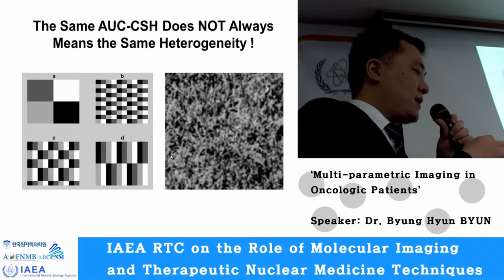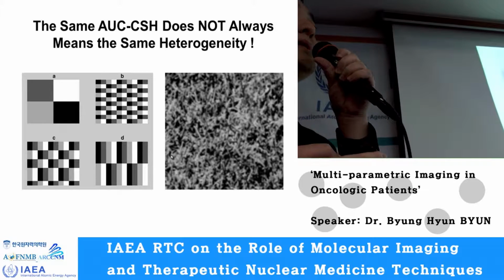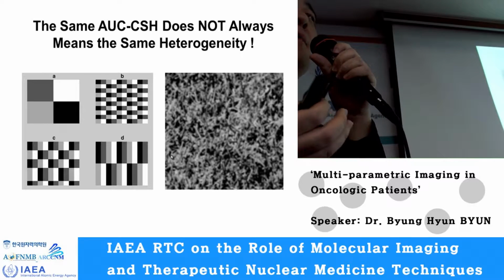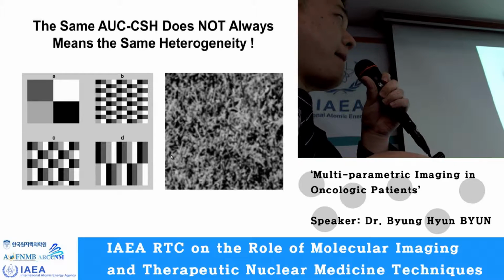Actually, this method was first applied to other images such as MRI. But recently there are many papers using texture analysis on FDG PET.